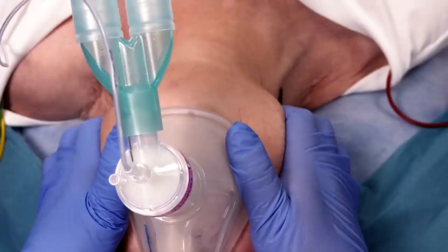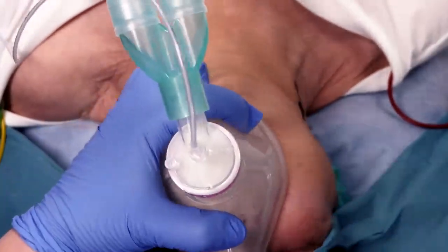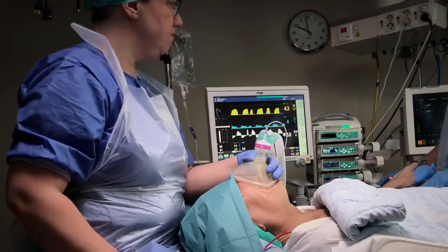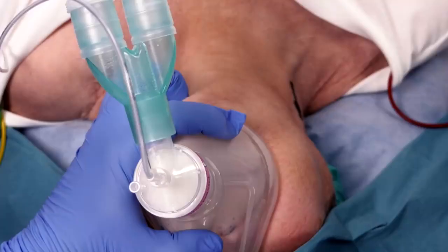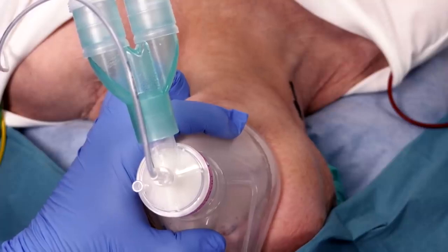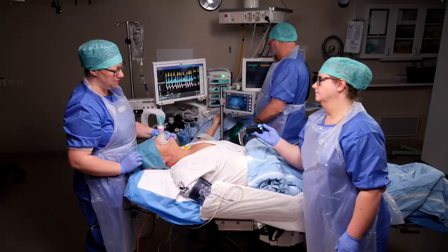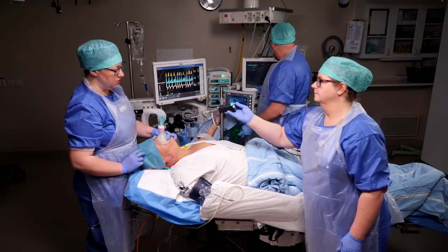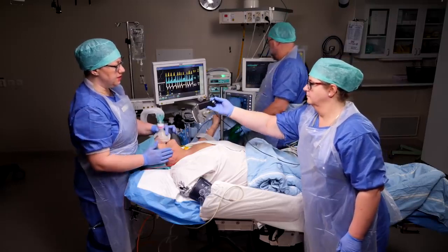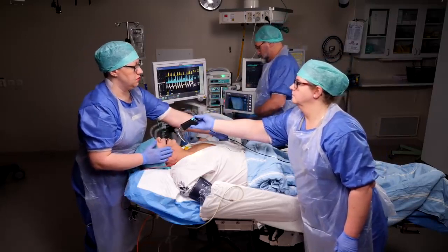While you wait for full onset of the drugs, take a moment to make sure that you have achieved absolute optimal positioning before proceeding to laryngoscopy. Do not forget that while you may hold the blade, this is very much a team effort.